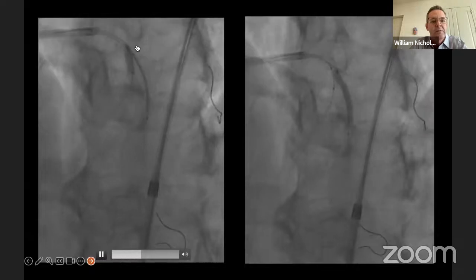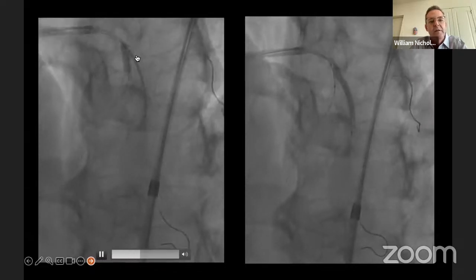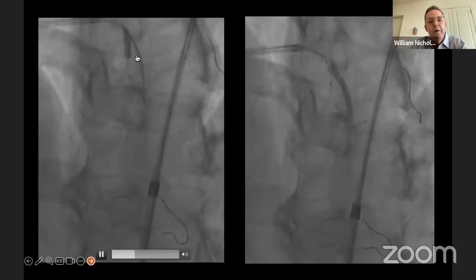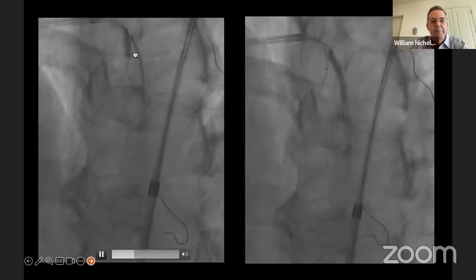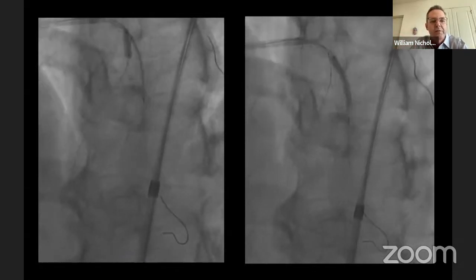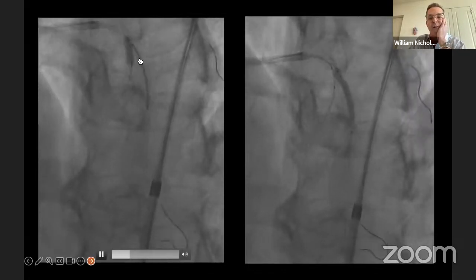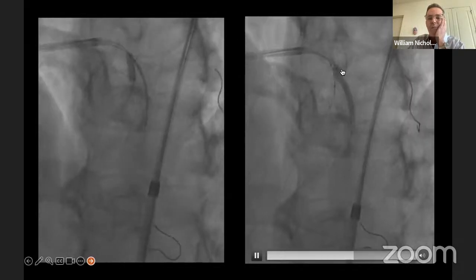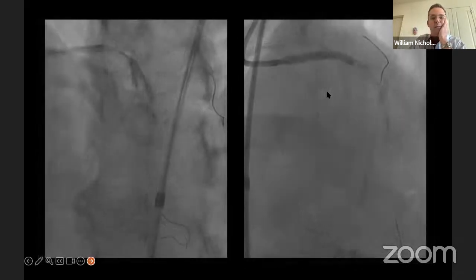stent. It's a 2.5 long stent, a 3.0 stent in the LAD, and you can see we've pulled this back and we're measuring to see exactly where they interact and where I can understand exactly the contact with the balloon. We look at this in multiple views. We do multiple times of bringing it back to have just enough into the main vessel, but not protruding too much that you're going to create a mini crush. And then we deploy the side branch with a balloon in place still. And then that's when you're going to do your first kiss.